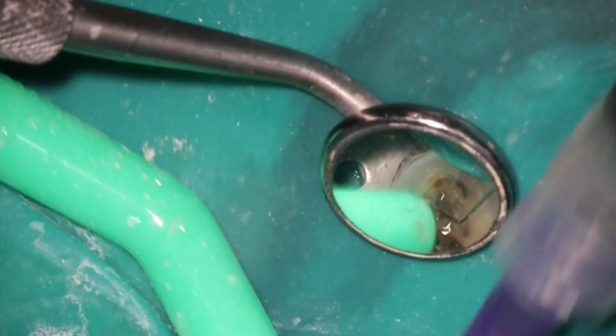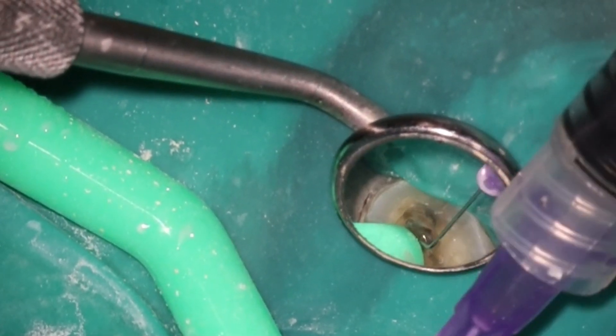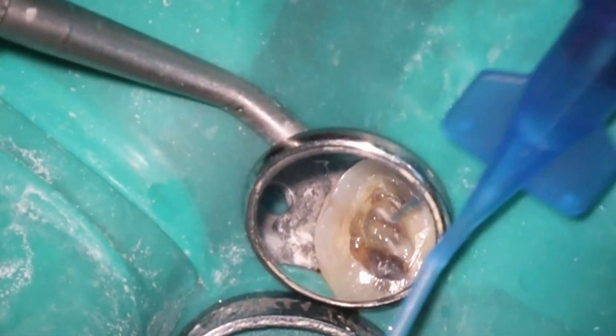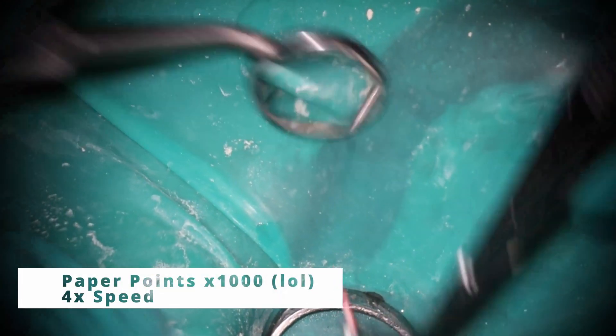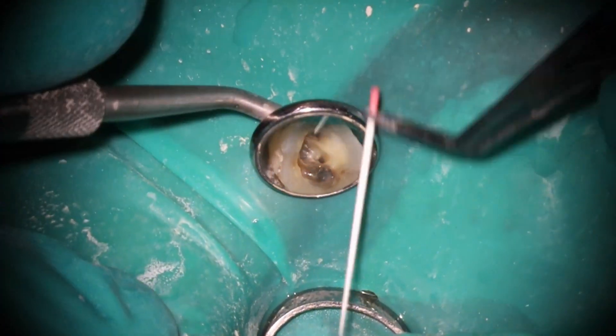We're finalizing the rinse here — I did speed that up as well because no one needs to watch me run Triton through a tooth for minutes. Then we're going to start the drying process. I wasn't sure if we were able to get everything dry, because every time you have a sinus that's really big you risk having some drainage after. If we weren't able to get it all the way dry — depending on how the patient is doing and how long you've spent — I was considering running the GentleWave. Otherwise I would definitely just use calcium hydroxide, call it a day, and bring the patient back in a month. There's nothing wrong with doing a two-step.